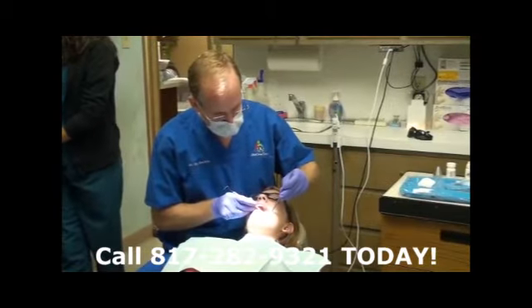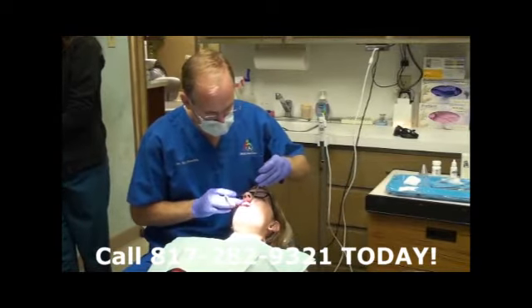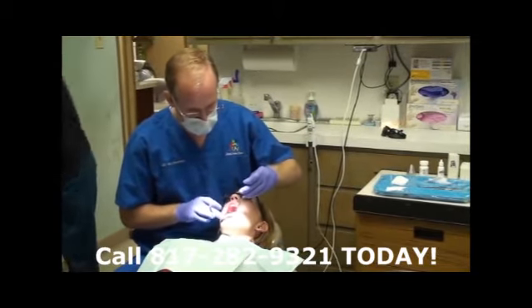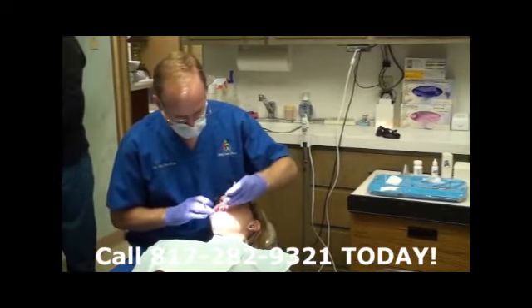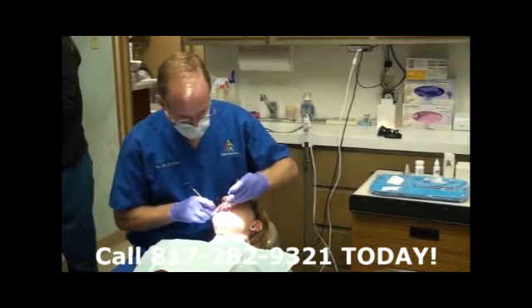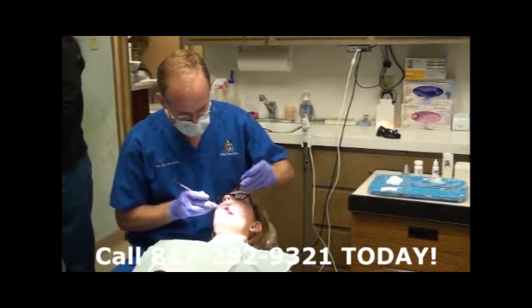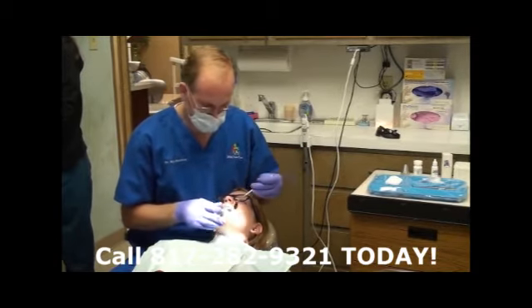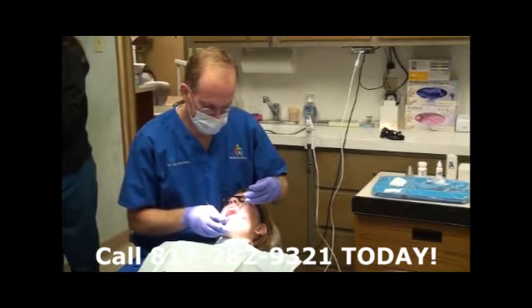I like to just check around the teeth and check around the gums. And you have a nice smile. You have pretty teeth. You have pretty nice straight teeth. Did you have braces or no? No? So you're one of those people that's really blessed with really nice straight teeth.